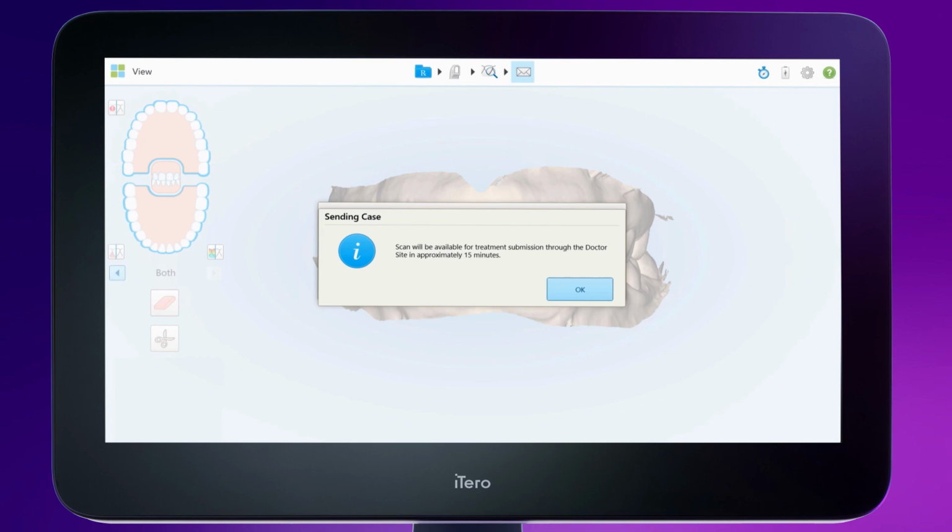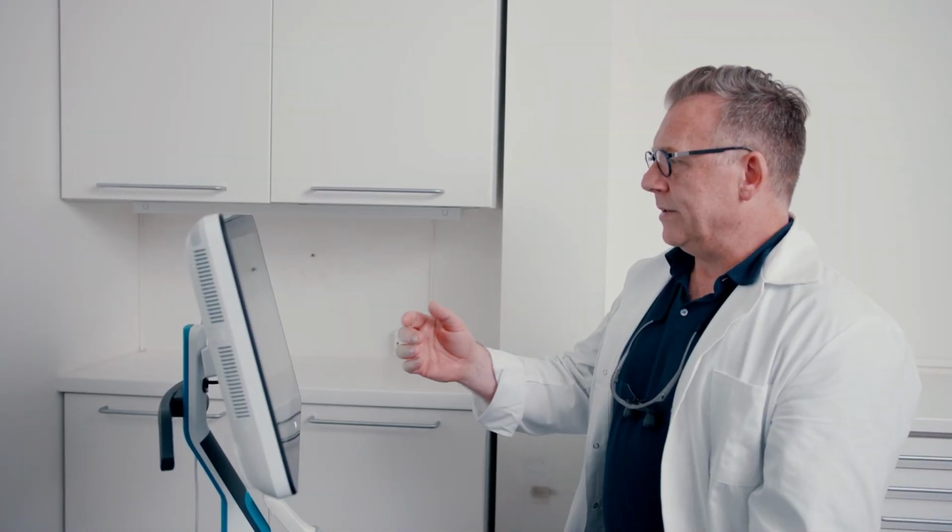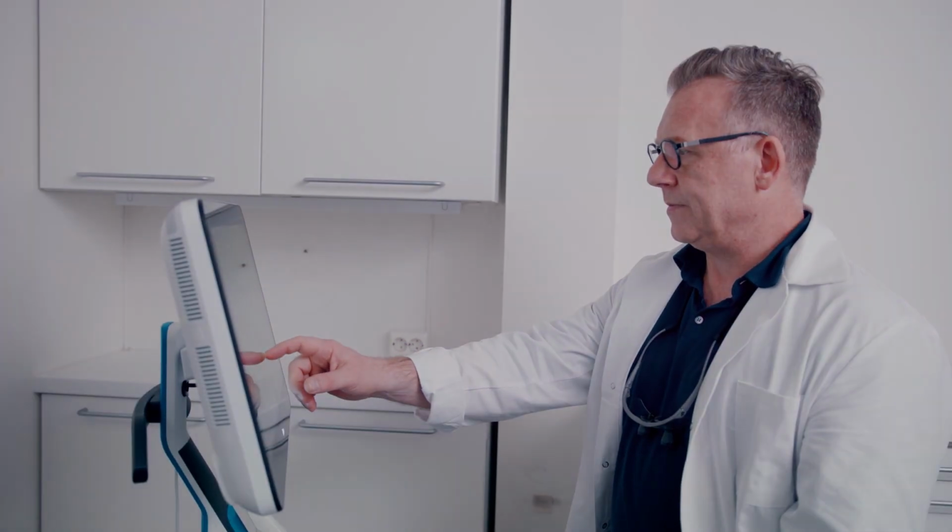Congratulations! You have completed the training video about full mouth scanning natural teeth powered by the iTero Element intraoral scanner, and you are now ready to practice scanning.